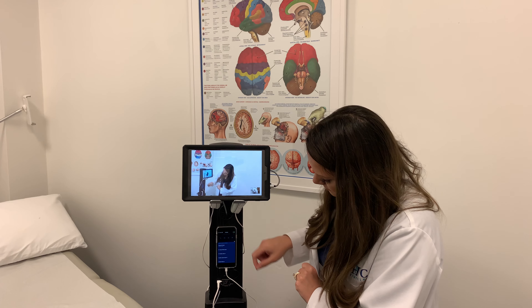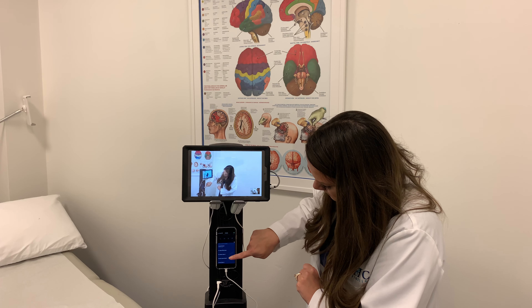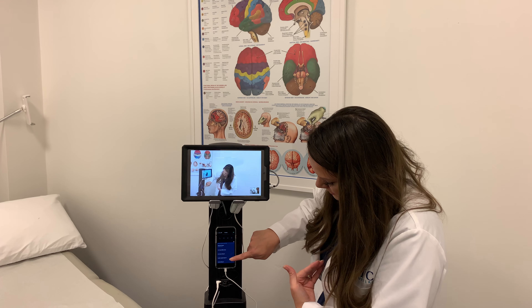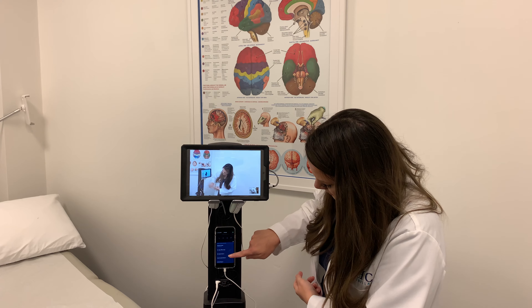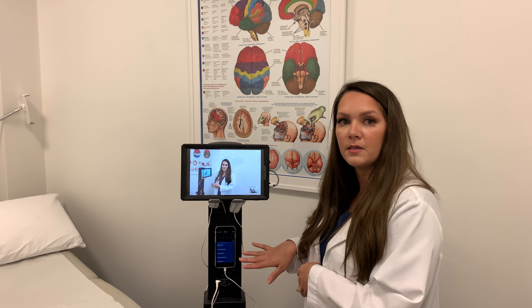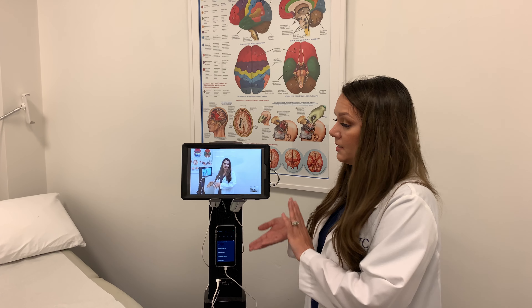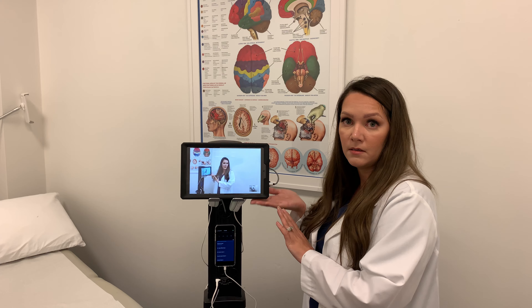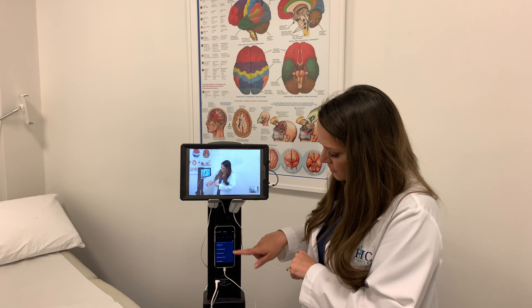Once the provider gets on, you'll see them — nice and clear. You'll take this entire station into the patient room with you. The patient will be popping up on screen; the provider can see them, you see them, and you see yourself, so you know what's going on.